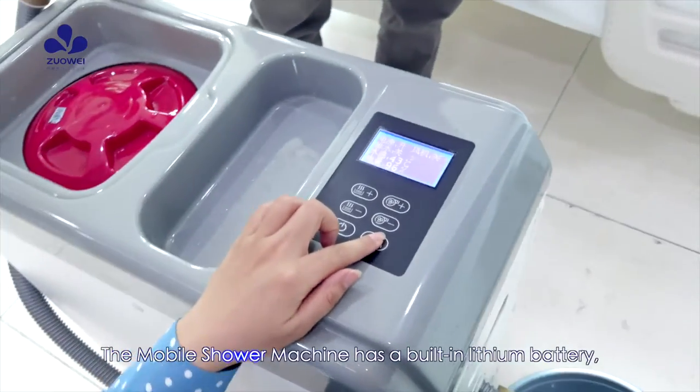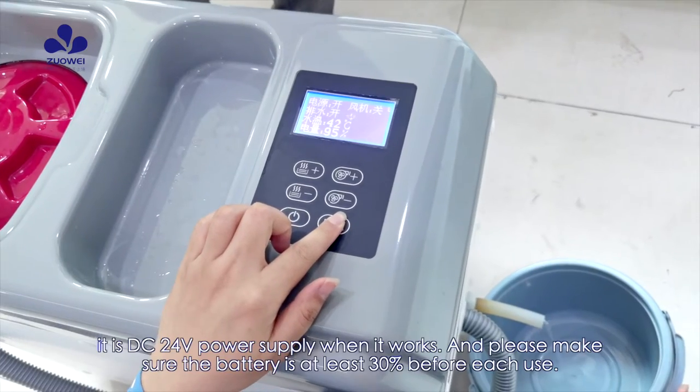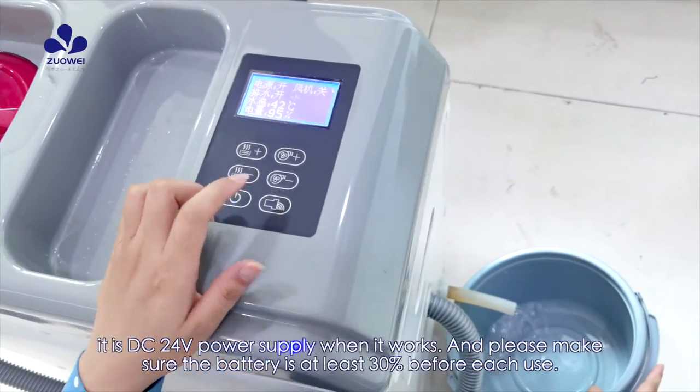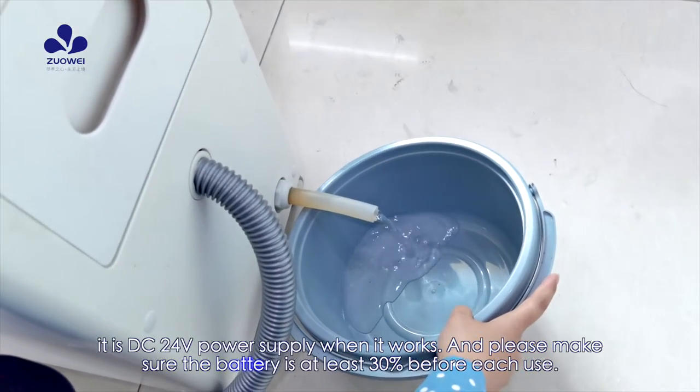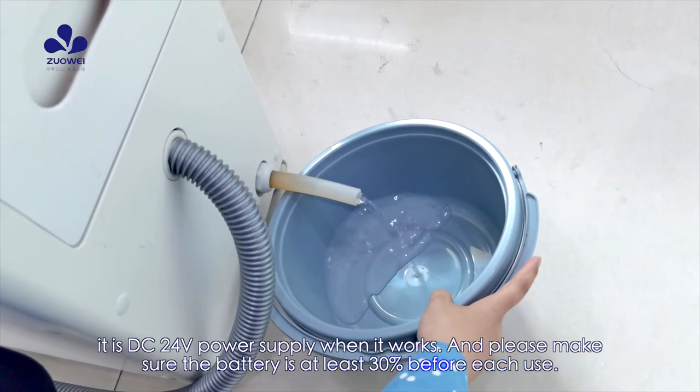The Mobile Shower Machine has a built-in lithium battery. It uses DC 20V power supply when in operation. Please make sure the battery is at least 30% charged before each use.